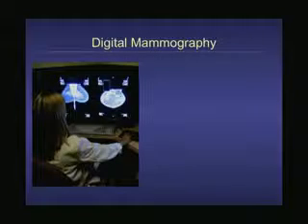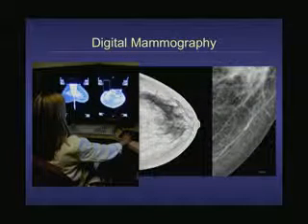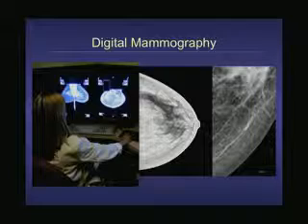But probably the main advantage, again, is that we get to sit at a workstation and look at these. We can invert the images, make them bigger, make them smaller, measure and annotate things, and we can change the level and the contrast to really see through dense tissue.